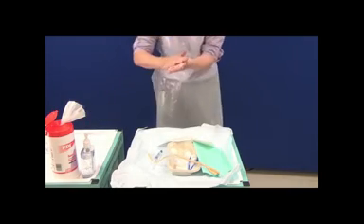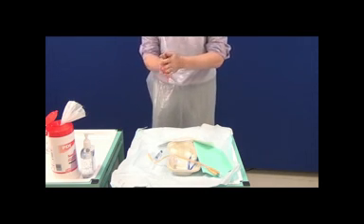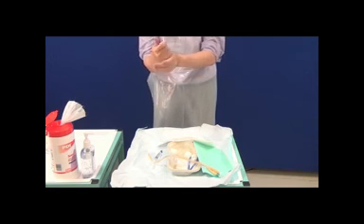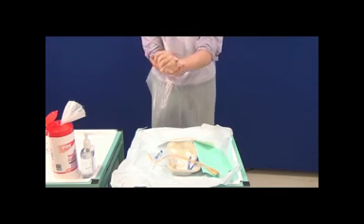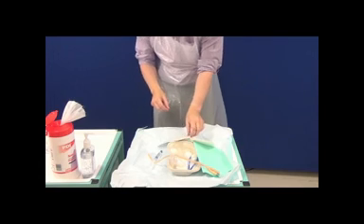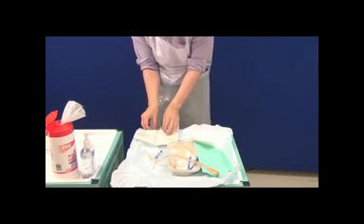Because you've been touching all the packaging and the bedding, wash your hands again thoroughly. Ideally this would be a soap and water wash at a sink. Don your first pair of sterile gloves.